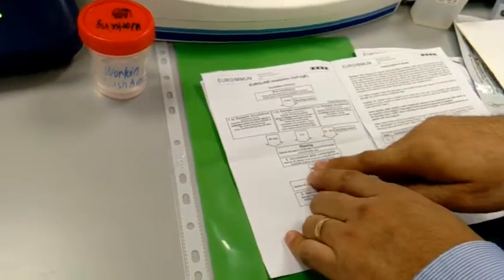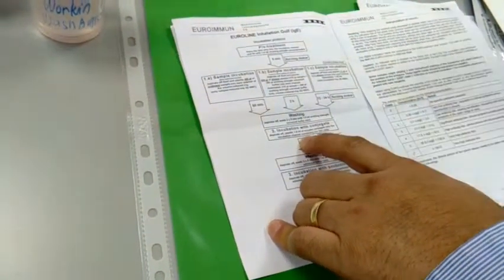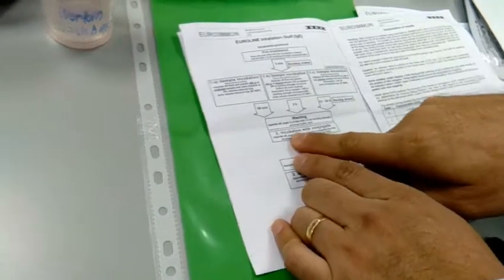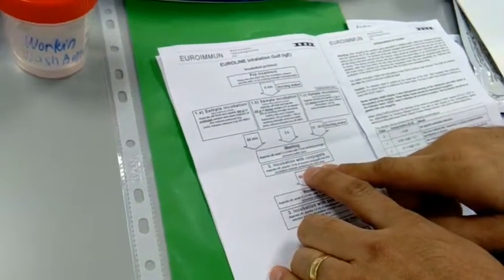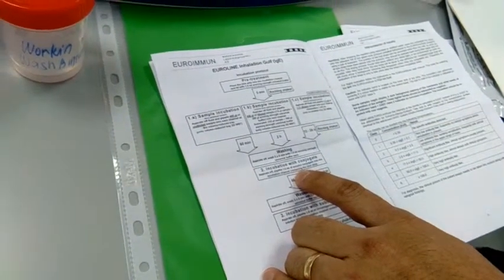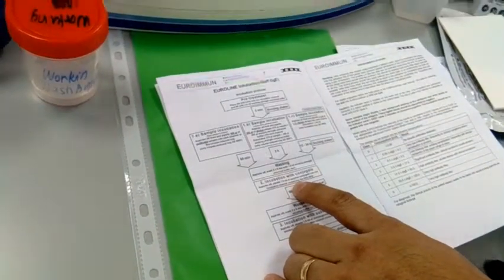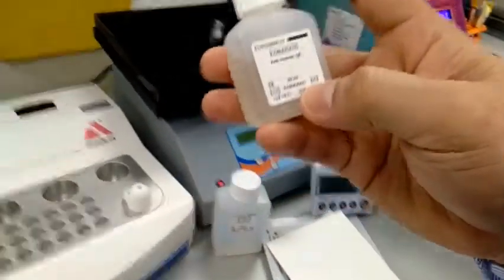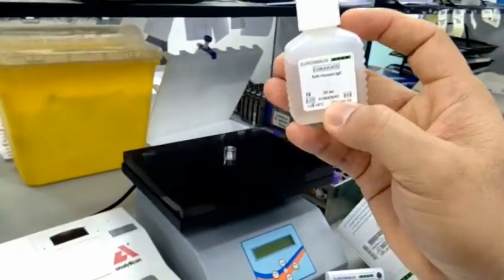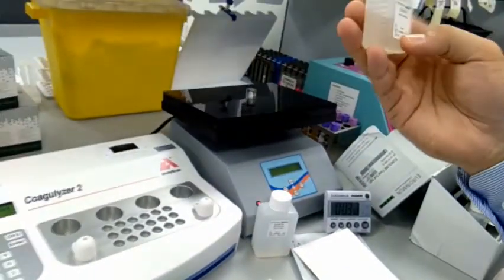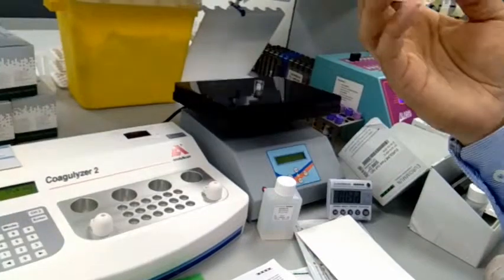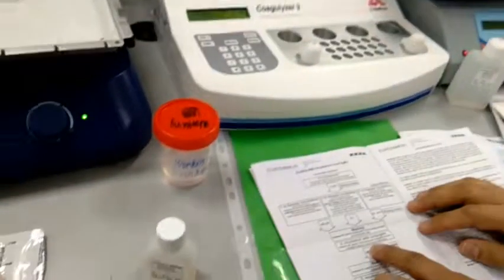And then again incubate with the conjugate. So we have to pipette it, 1ml of the enzyme conjugate. So this is the conjugate, this is 20 ml. Anyway, you have only 16 strips, so you have at least 4 ml left.